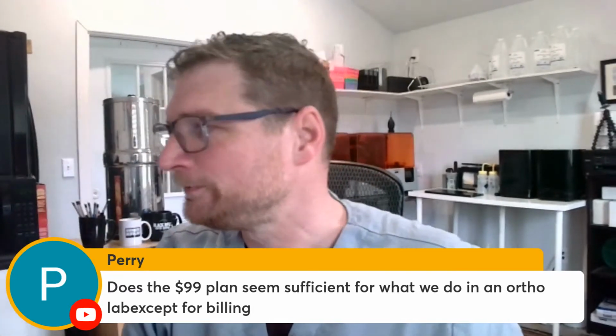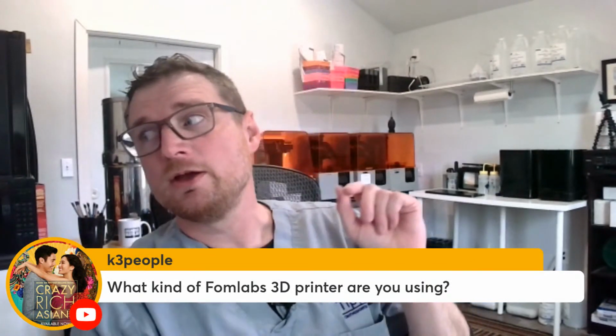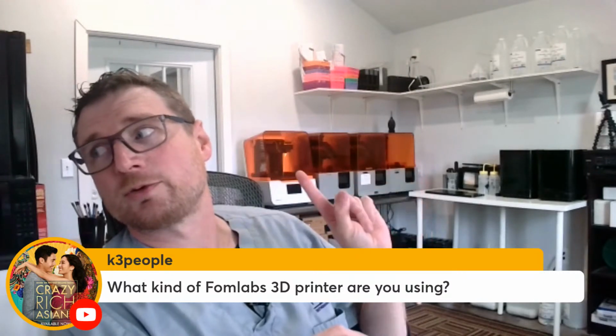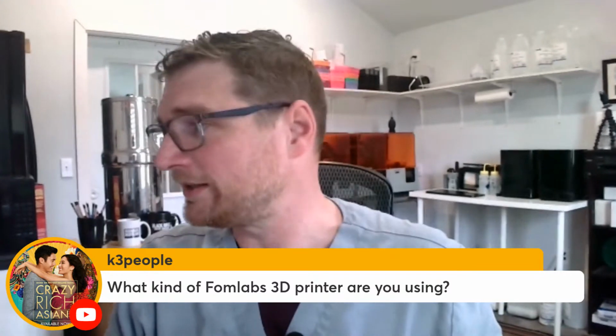So it's pretty cool. What kinds of Formlabs printers are you using? I'm using Form 2. I've got 3 Form 2s and a Form 3. So those are the printers, and I'll go over those a little bit when we get to that point.